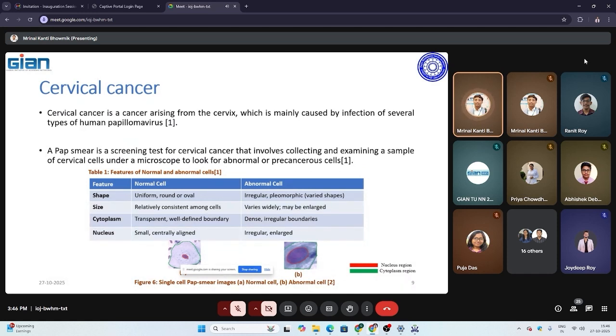In the visual analysis of cells in a pap smear, the correct characterization of microscopic slides and drawing of any conclusion thereof depend mostly on the general appearance of the nucleus of the cells or the sizes of the cell. From the pathological point of view, the nucleus of an infected cell may be enlarged with a possibility of increased DNA content or irregular chromatin density and irregularity in shape.